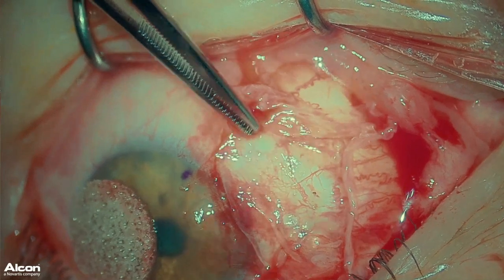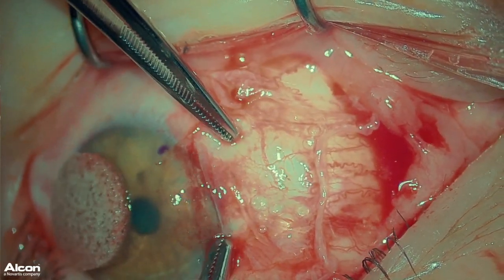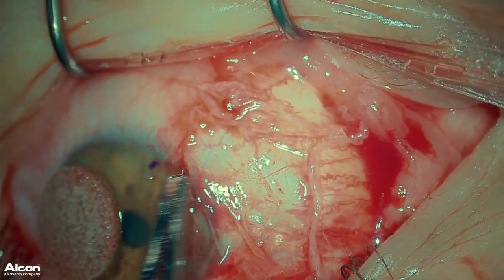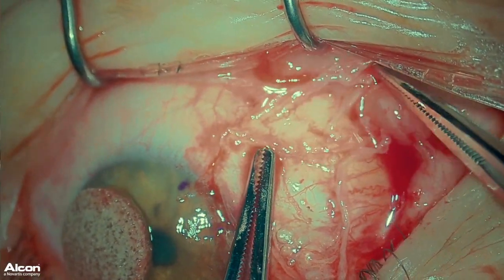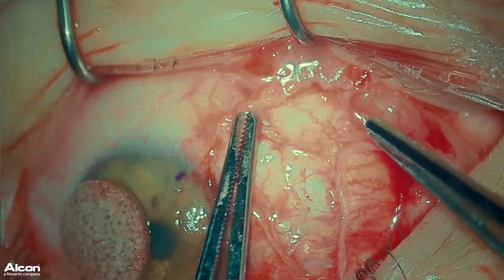I then make sure to properly smooth out the graft. You want to ensure that the graft edge is abutting the edge of the cornea, and making sure that all components of the graft are tucked under the conjunctiva.